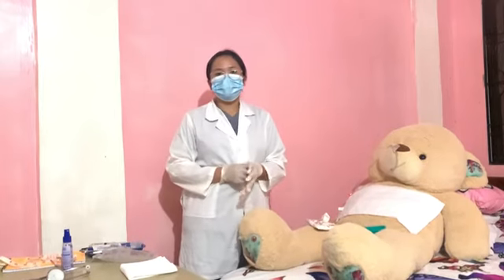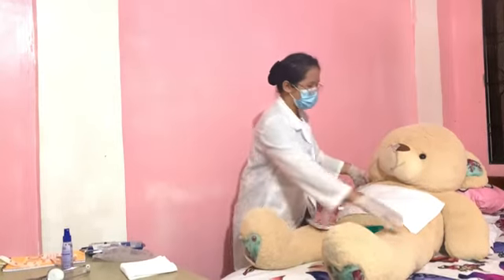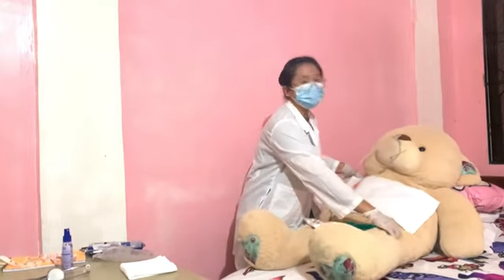Ask the patient to turn the head to the side opposite of the nostril in which the tube is inserted. So, ma'am, turn to the side. And then, secure the tube to the patient's gown by using a rubber band or a tape or a safety pin.